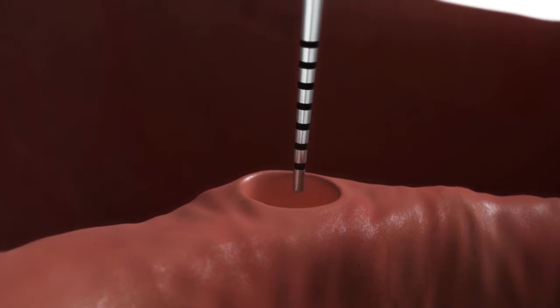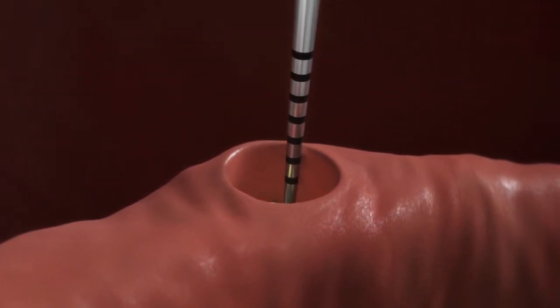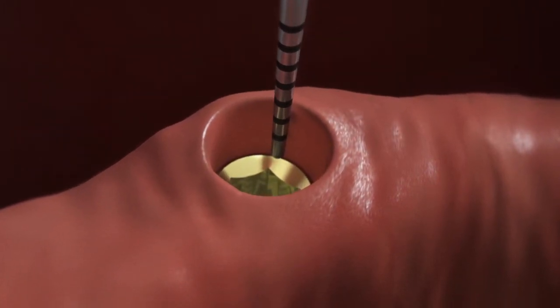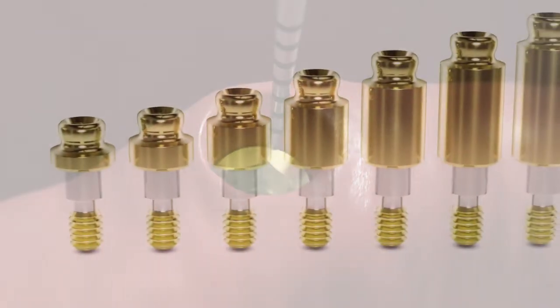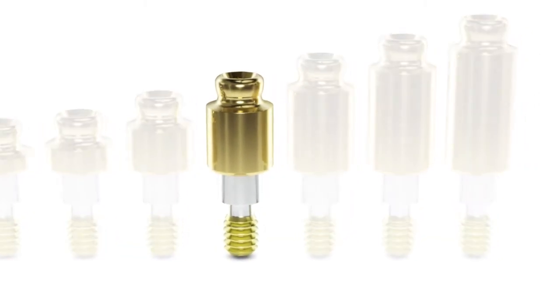Select an OD Secure abutment based on the prosthetic platform and the tissue height. Measure the tissue height from the top of the implant to the top of the gingiva at its highest point. Choose the abutment cuff height that is equal to or slightly taller than the tissue.